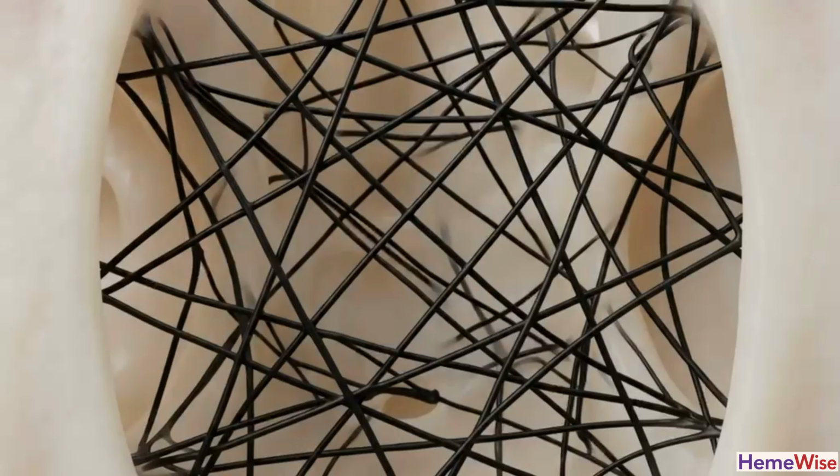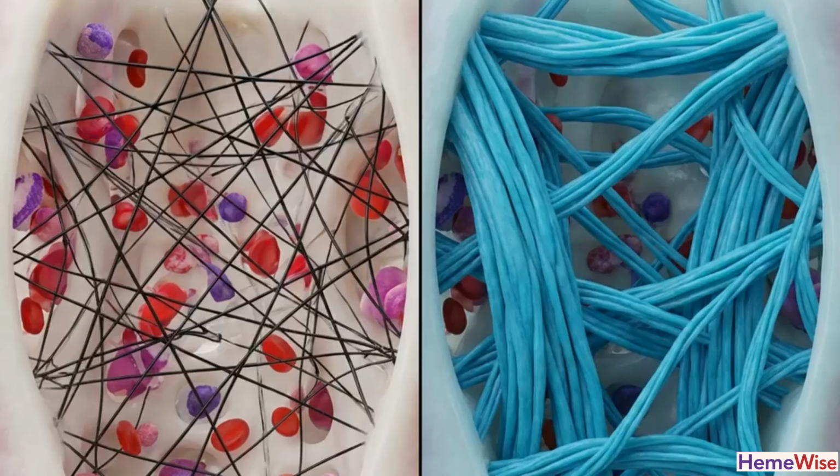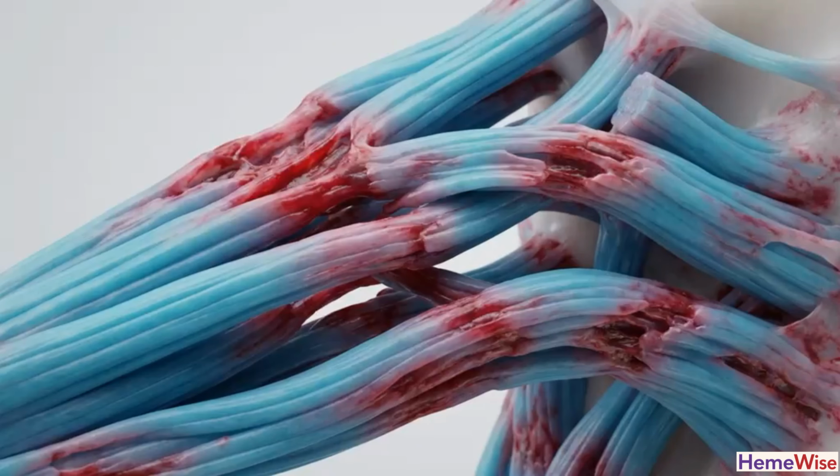This grading is based on the density and intersections of the reticulin fiber network. We distinguish between reticulin, type 3 collagen, which is potentially reversible, and true collagen fibrosis. The latter indicates advanced permanent stromal alteration and is identified using a trichrome stain.